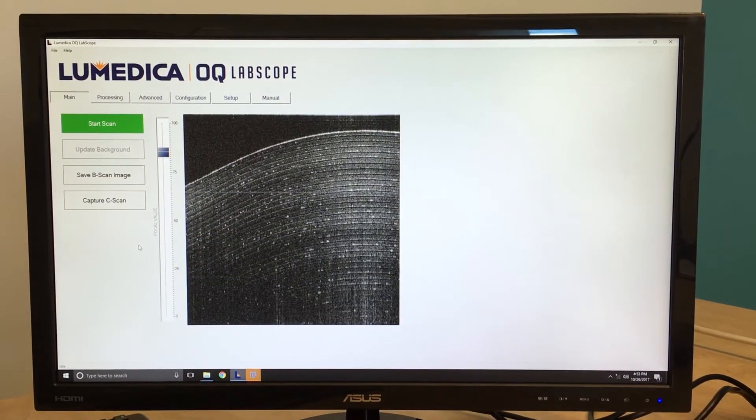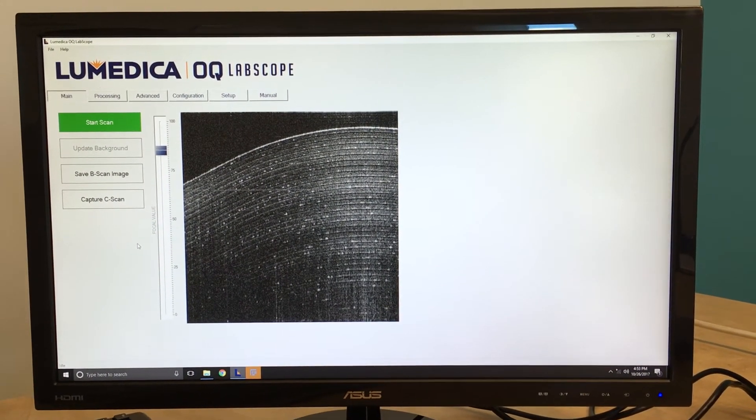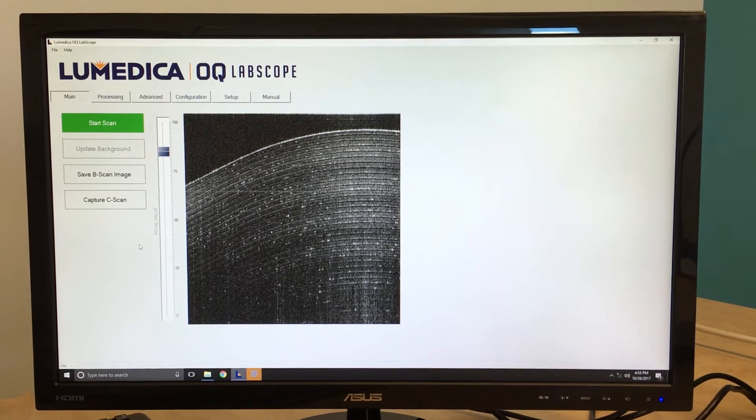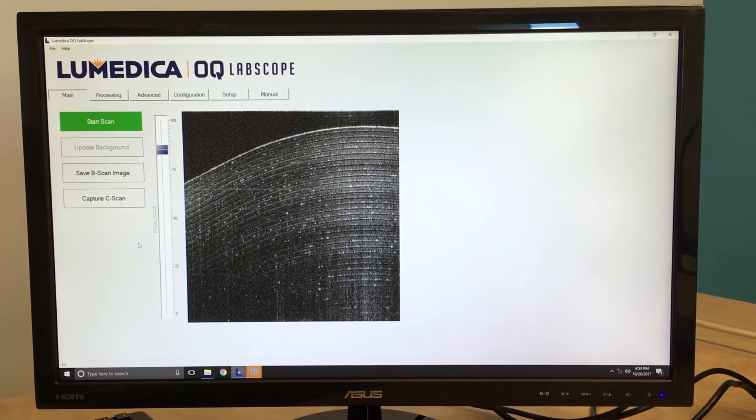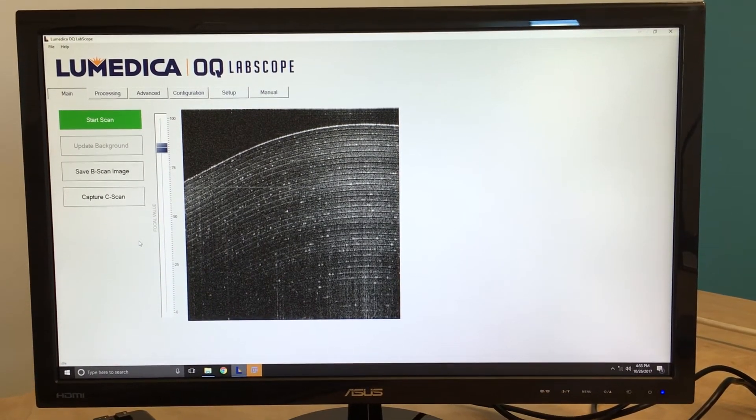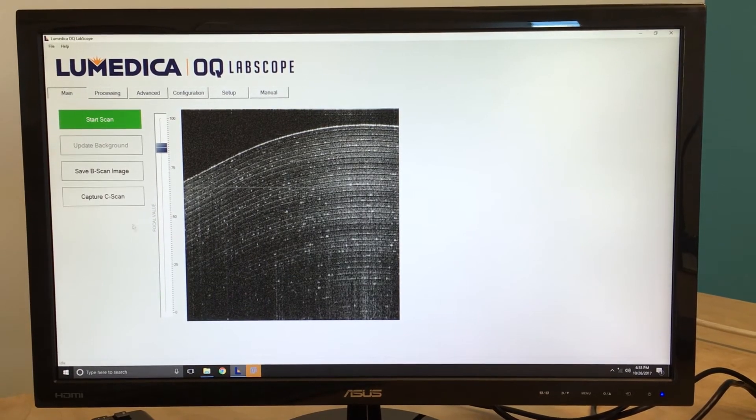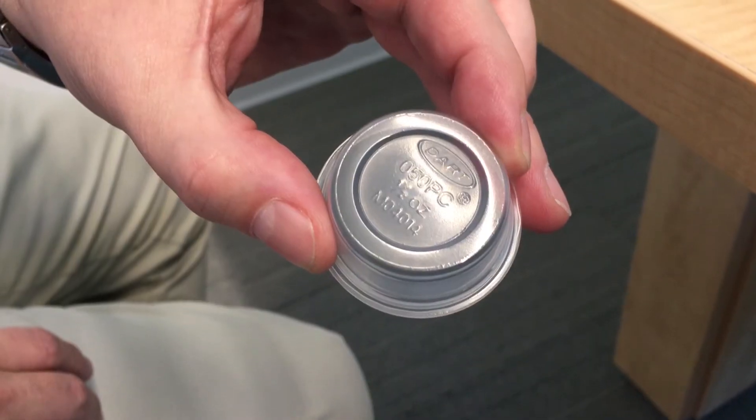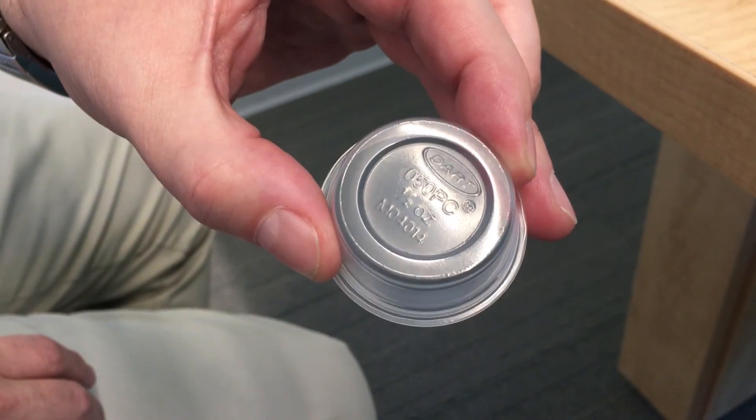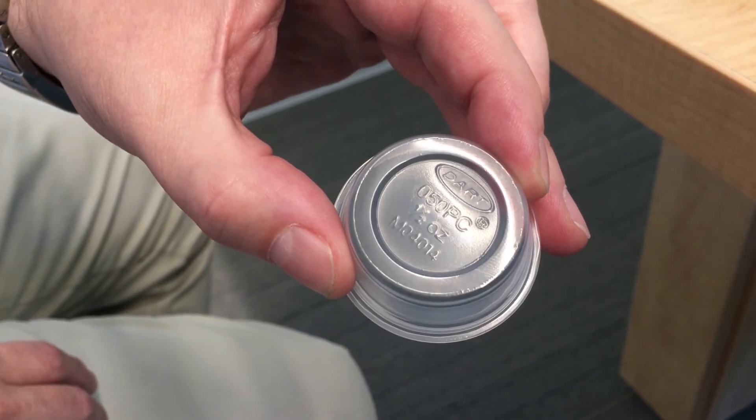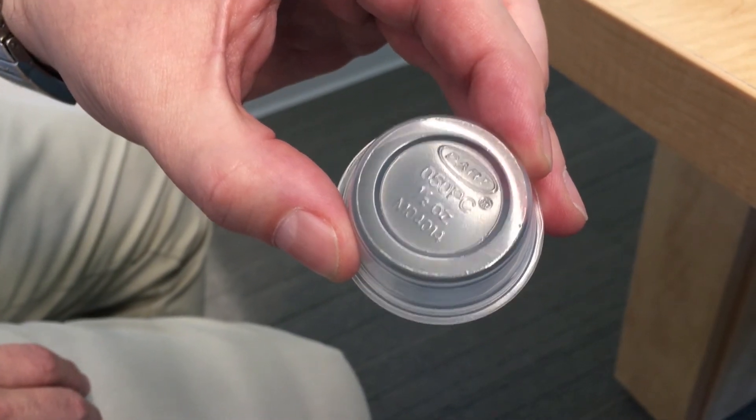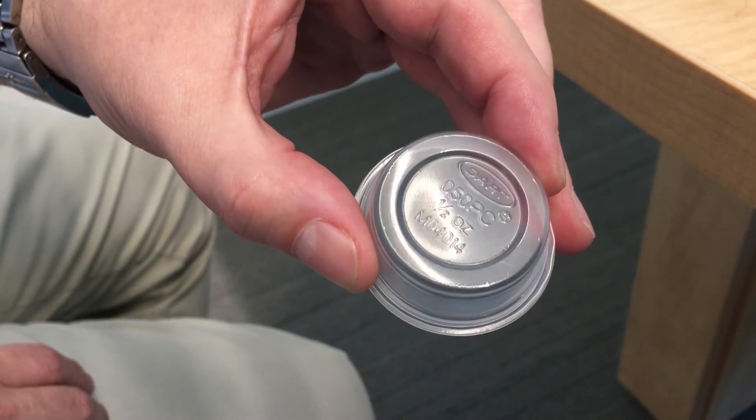The Labscope software will also let you capture 3D volumetric images. All you need to do is position your sample and click Capture C-scan. For example, we're going to show a 3D scan of this plastic cup, zooming in on some of the letters in the writing.